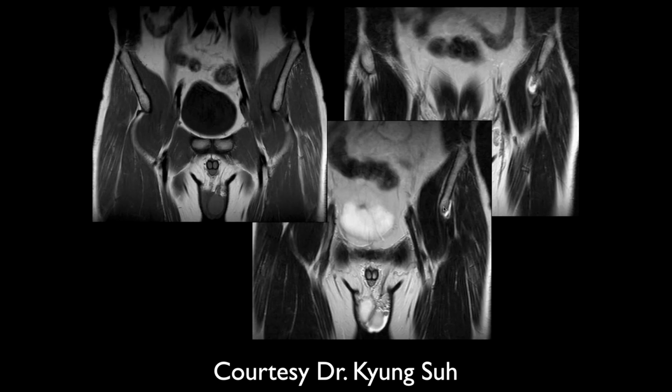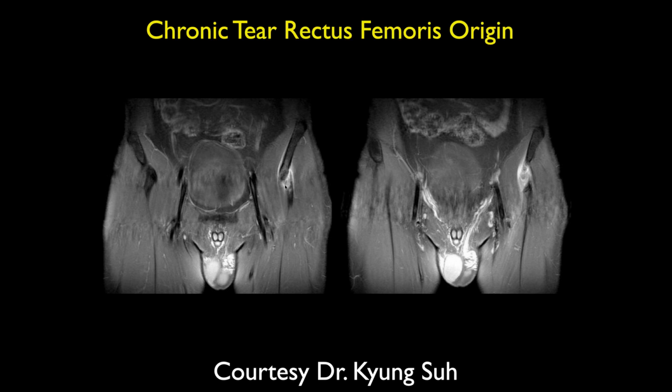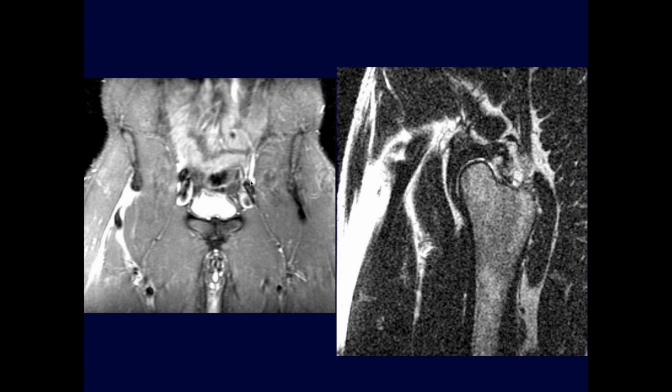Here's some more evidence. Okay. Here we can see another injury in that same anterior inferior iliac spine area. Okay. I can't hear you very well, John.